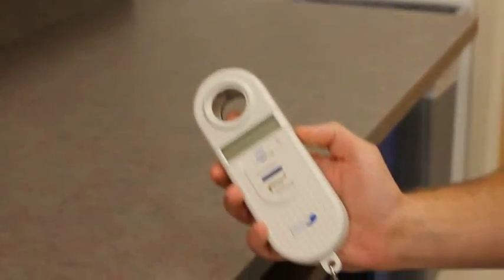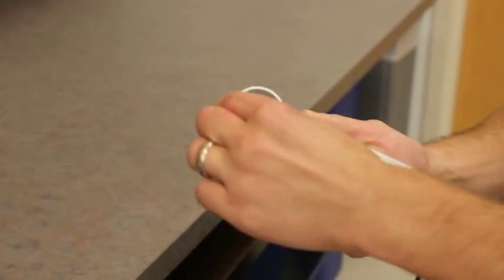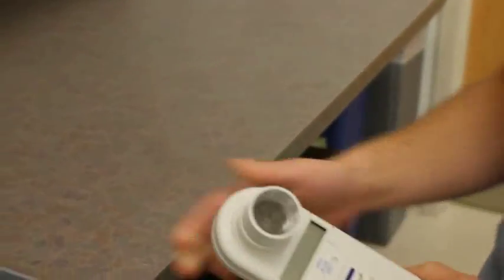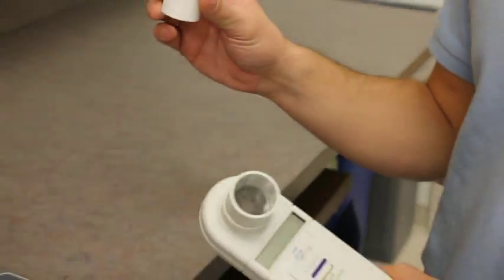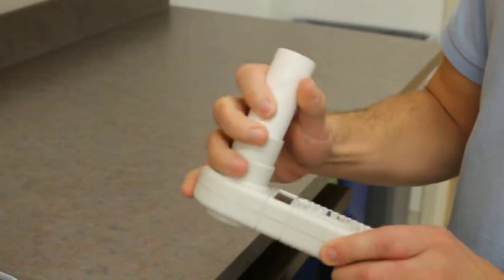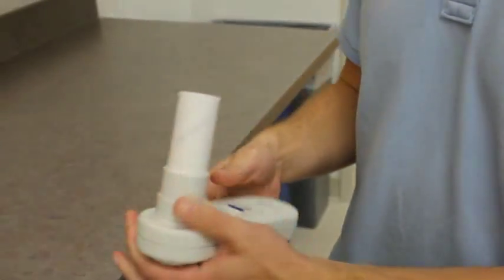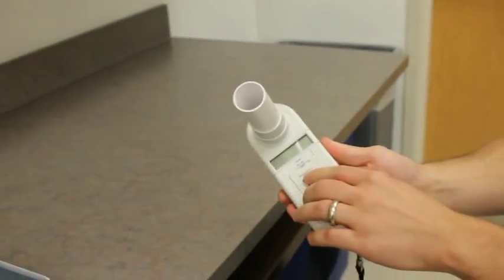Then you take the mouthpiece and that just fits in there and slides in. Okay, and then there's three menu options: off, blow, and view. So you just want to switch from off to blow.